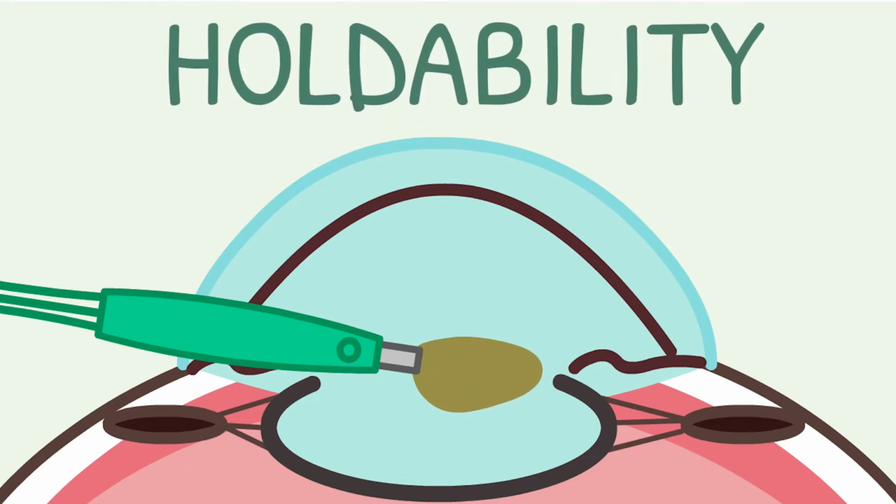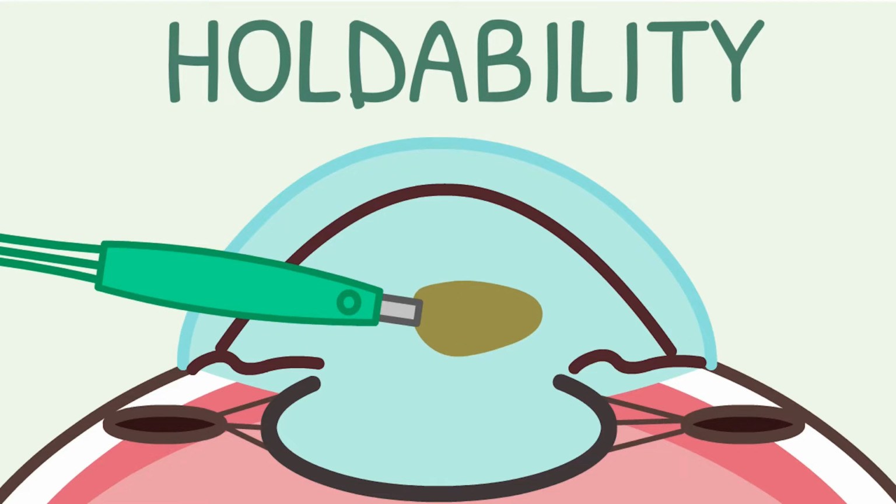Holdability is a function of the vacuum, as we mentioned. If the vacuum is high, the nucleus will be held forcefully by the phacotip. And if the vacuum is low, it barely holds the nucleus.